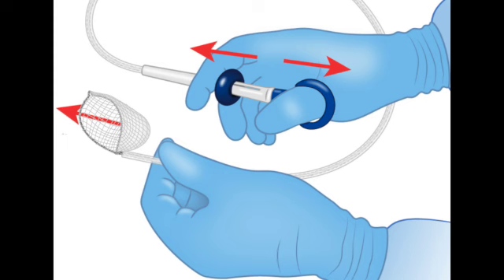Okay, wait. Why is that so bad? Can't they just fish it out later? Well, you could, maybe, but it totally messes up the chain of custody, which is crucial. The lab needs to know, with certainty, not just what tissue it is, but which specific polyp it was, from where in the colon it came, and from which patient. Throwing it in the general waste bin, you lose all that specific location context. Diagnosis becomes, well, potentially impossible or unreliable.